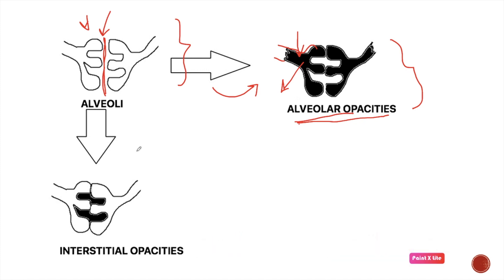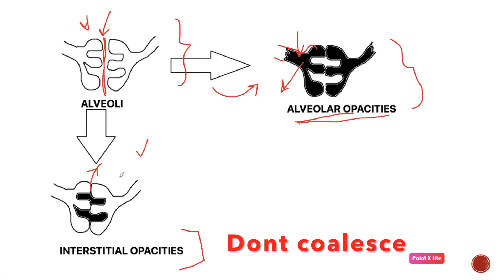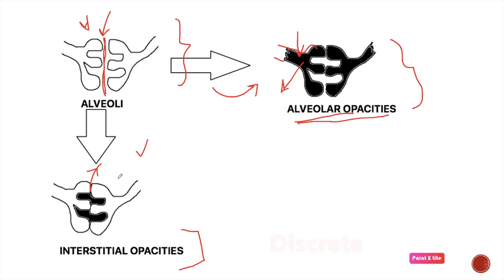The next type of opacity is called interstitial opacity. Interstitial opacities are opacities seen in the connective tissue surrounding the alveoli. They do not coalesce with each other, unlike alveolar opacities, and appear discrete.